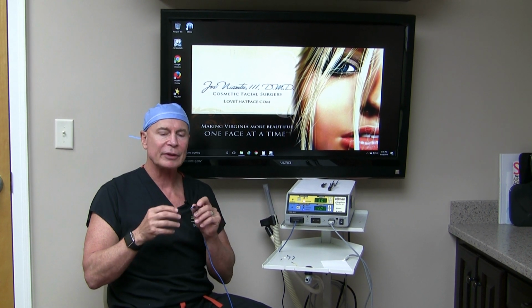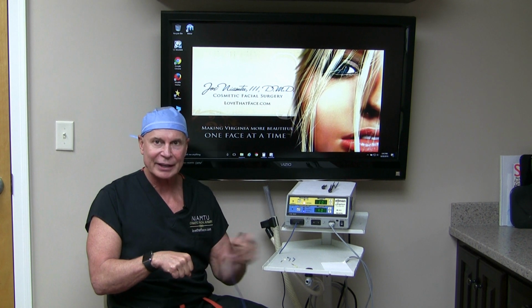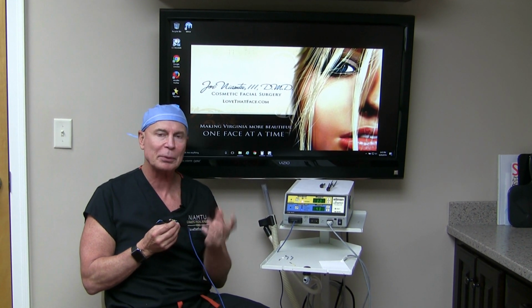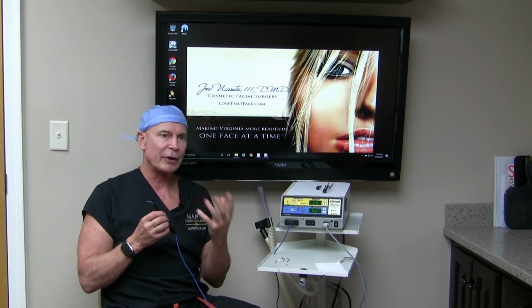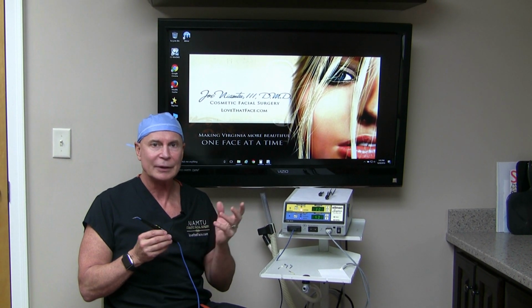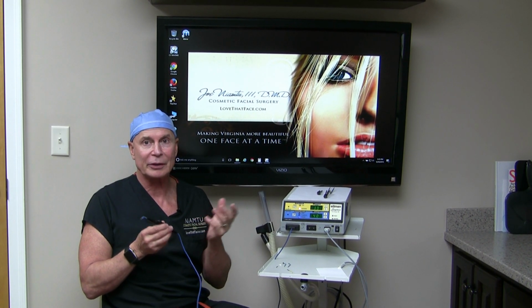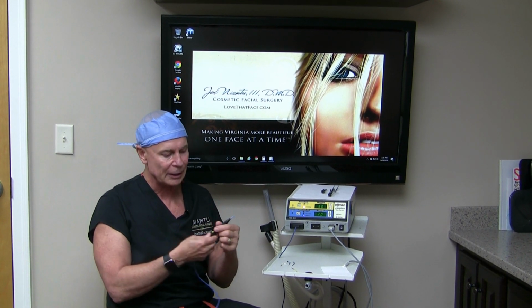And if your power is too low, it's going to not glide through the tissue. It's going to kind of catch. So probably we're using 20 for the most part, but you have to play around with this, and it's also different on some patients, and I'm not sure what the variables are, but on bigger patients that may have, you know, more resistance to electricity and those kind of factors, you may have to tweak this. So on some patients it may be 30, other patients it may be 15, but we pretty much put it on 20 and leave it on 20.